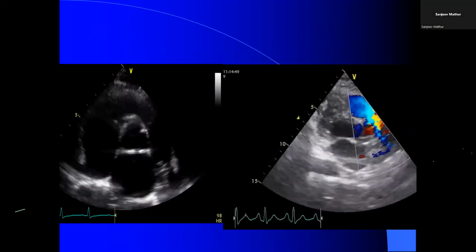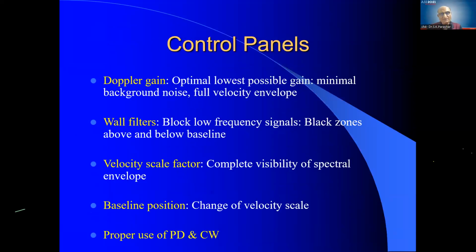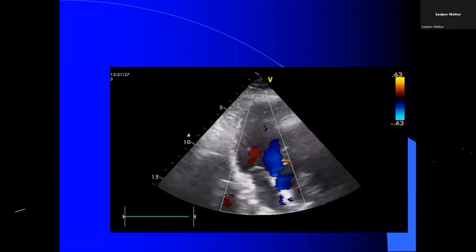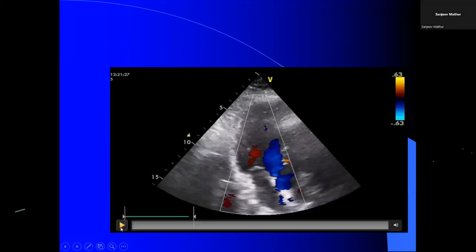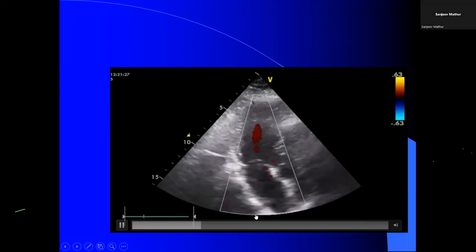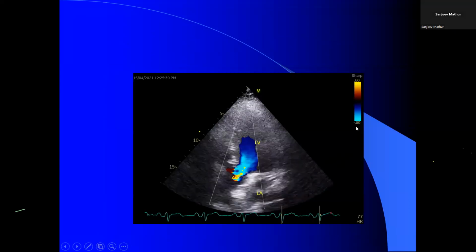This is always shown on the color flow map. The scale on the right corner, on the top right: how do you correlate it with the flow? For example, it is 0.59, 0.60 here, correct?